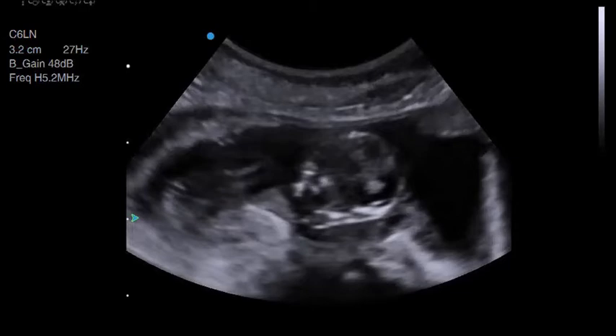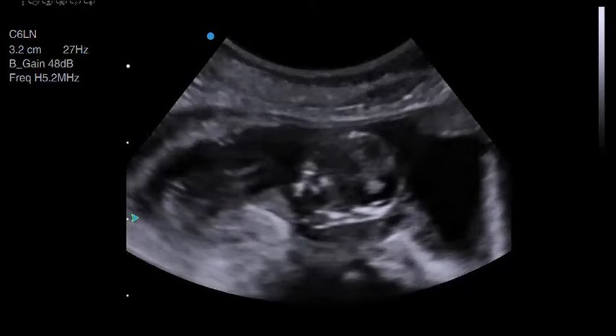In this instance it was particularly useful because the puppy's skull was so close to the transducer, and I needed to clear up the image to be able to perform an accurate biparietal diameter.